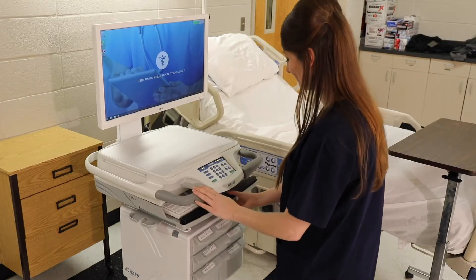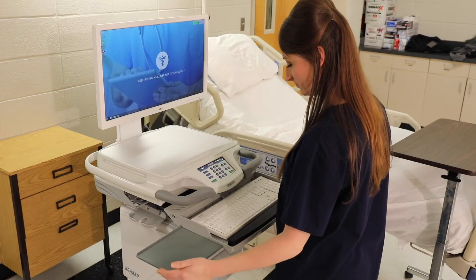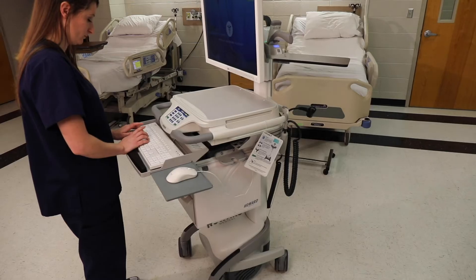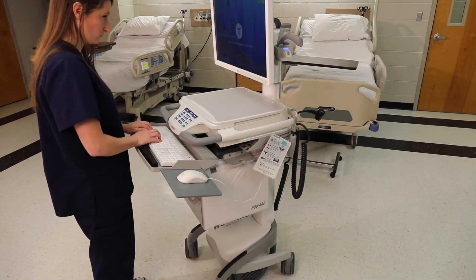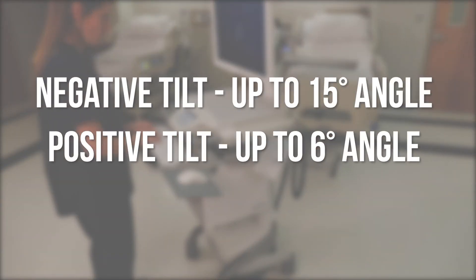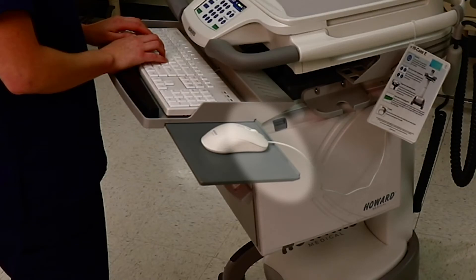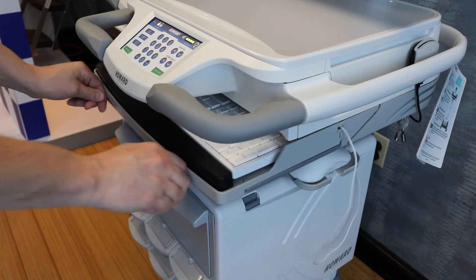Our keyboard tray retracts under the work surface when not in use. Pull the tray out to access the keyboard. The mouse tray is located under the keyboard tray and is accessible from the left and right-hand side. To alleviate wrist strain while typing, the keyboard tray is integrated with the wrist rest along with a negative and positive tilt function. The negative tilt will adjust up to a 15-degree angle and the positive tilt will adjust up to a 6-degree angle. When negative tilt is engaged, the mouse tray has a raised rear edge that keeps the mouse from sliding off. The keyboard tray will automatically return to its level position as you return it to its retracted position.